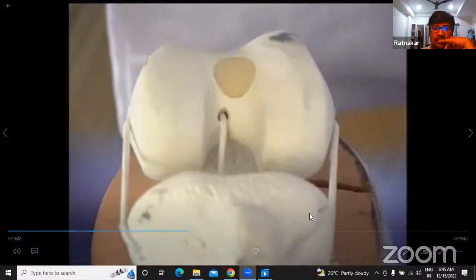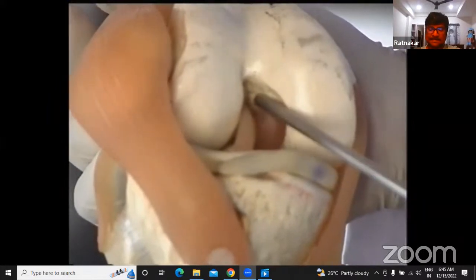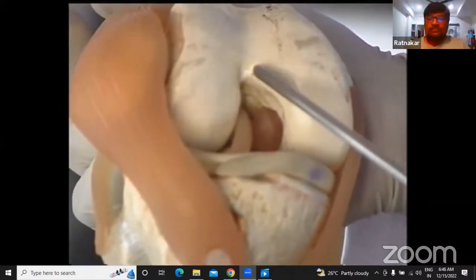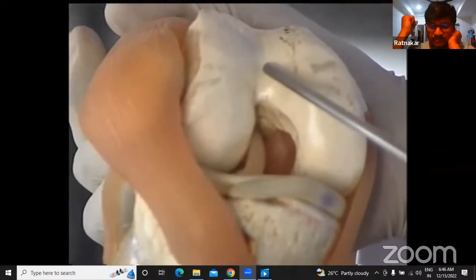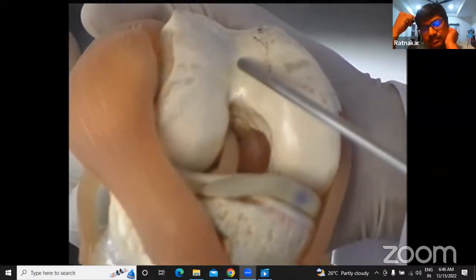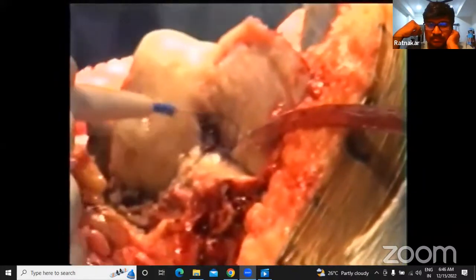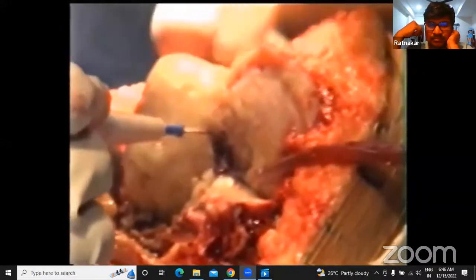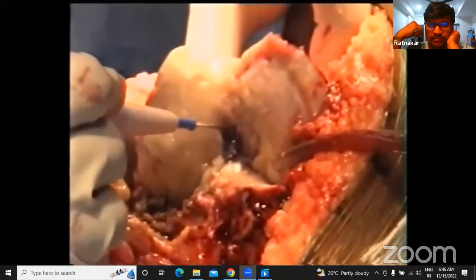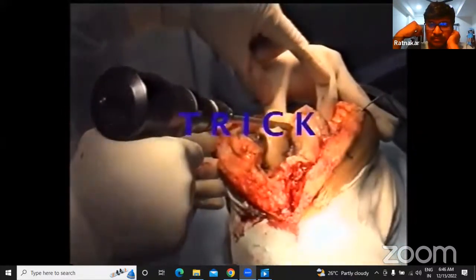If you take the knee model and see the anatomy, that is the close-up of the intercondylar notch, and these are the anterior cruciate ligament and the posterior cruciate ligament. The entry hole is ideally 1 centimeter anterior to the cruciate ligament attachments, almost in the midline. Sometimes this intercondylar notch will be masked with osteophyte, then you have to clear that. So our first entry hole will be 1 centimeter anterior to the intercondylar notch or the attachment of the PCL. Somewhere there.